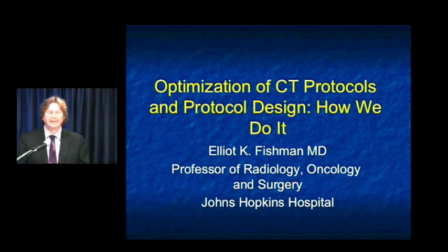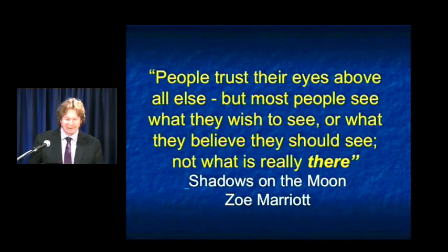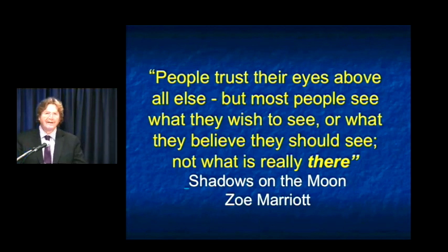Hi, this is Elliot Fishman, and in this talk, I'm going to get to the real basics and basis of CT, looking at protocols and protocol design, sort of how we do it. There's no doubt that when you look at CT and you look at your accuracy, it really is dependent on how you do the study.